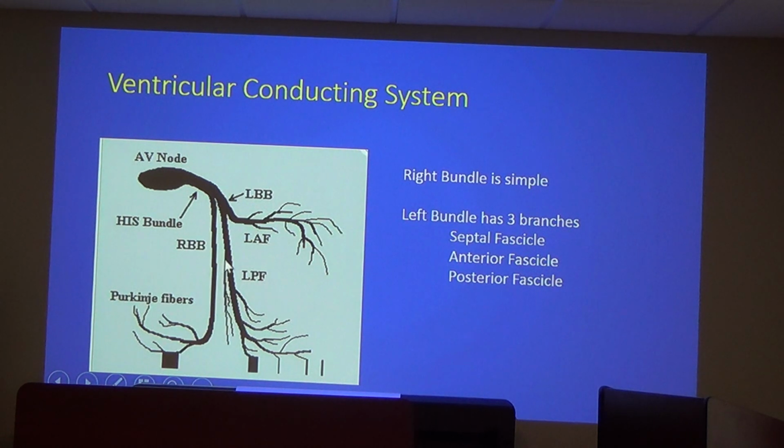And then you think that's super interesting and you get all geeked out on it, and then you find out that in the real world, nothing's pure or true, and there's lots of these little things that still show up, even though it's pretty much mostly a left bundle.